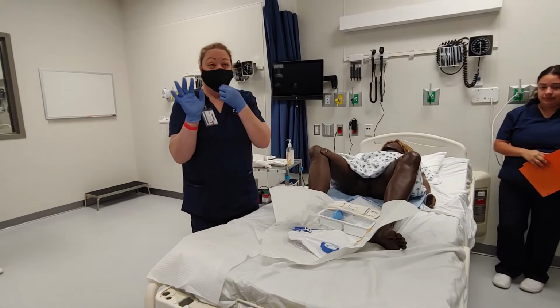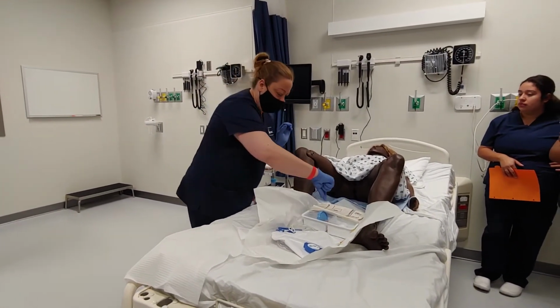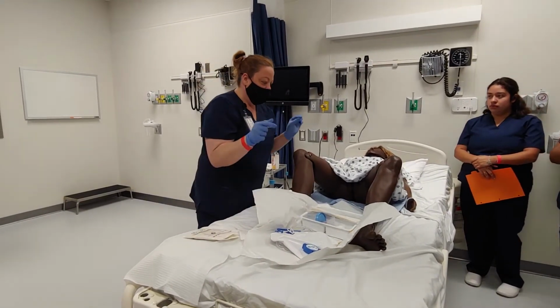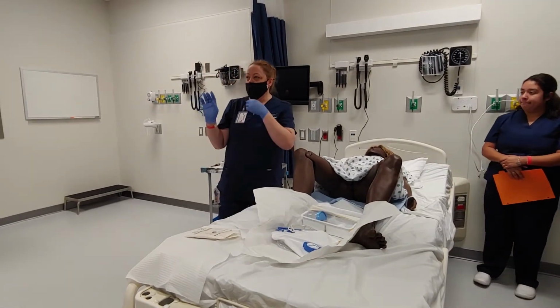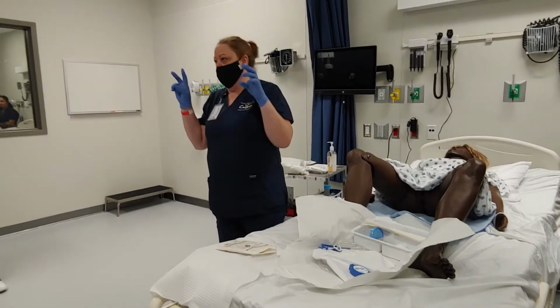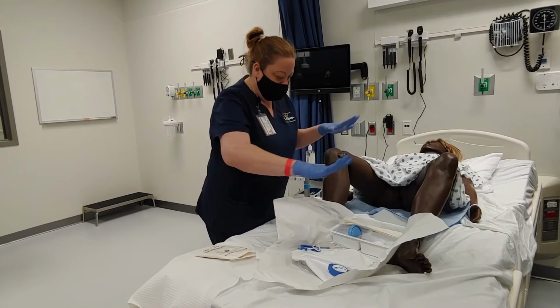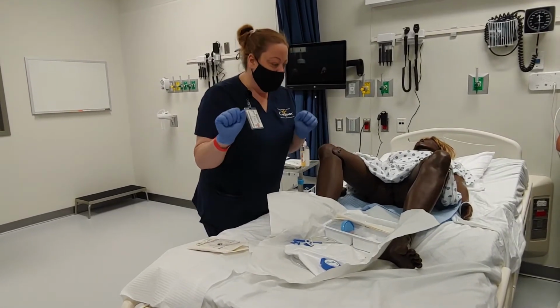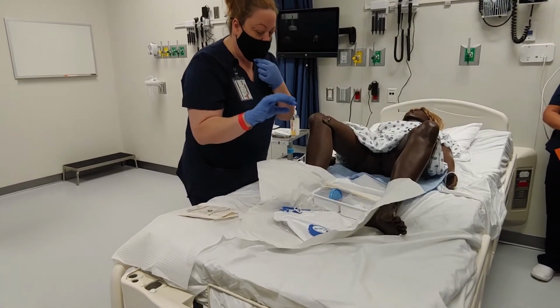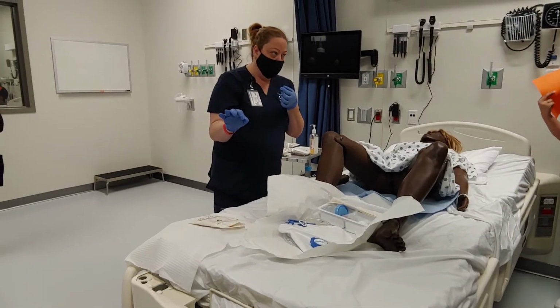To do that, I need to have on my sterile gloves. However, keep in mind, and you guys know how to put on the sterile gloves now, keep in mind that one hand will remain sterile the whole time while the other one will be considered dirty. Okay, and you'll understand why here in just a minute. So I've got my sterile field set up here. Now I need to go ahead and get the rest of my items out here. But before I do that, I need to go ahead and put on my sterile gloves.